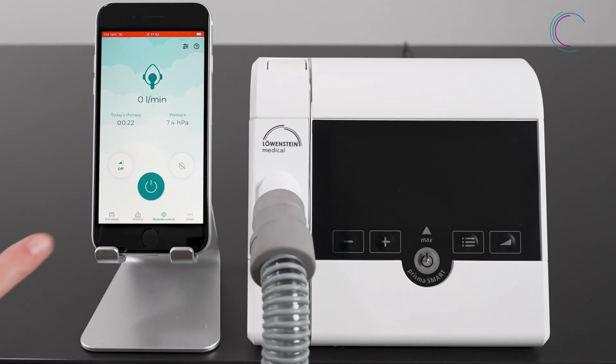When you would like to stop your therapy, press again the on-off button. Your therapy is stopped. The therapy data is automatically saved and transferred.